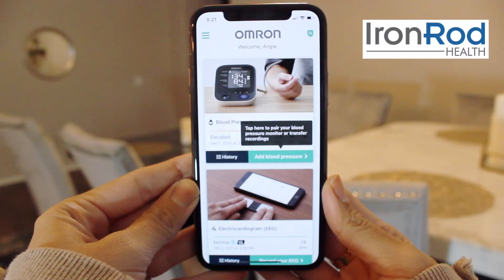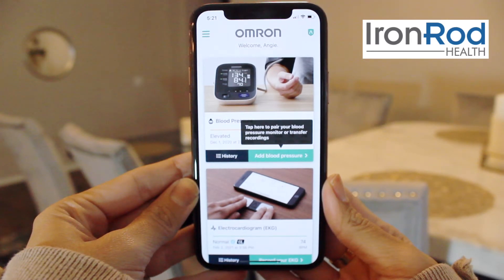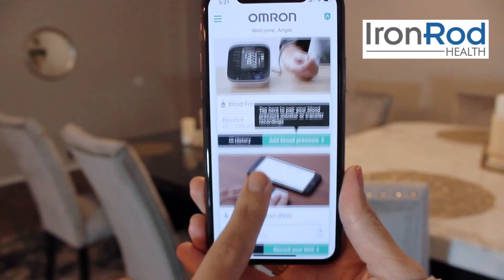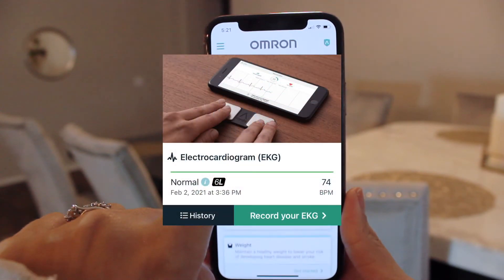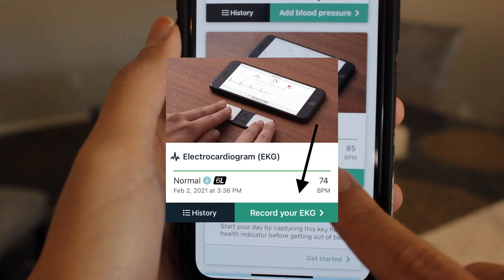Once you've logged in, you should see the Omron welcome page and your name at the top of the screen. We are going to scroll down until you see electrocardiogram and this image. Once you've found it, press the button that says record your EKG.